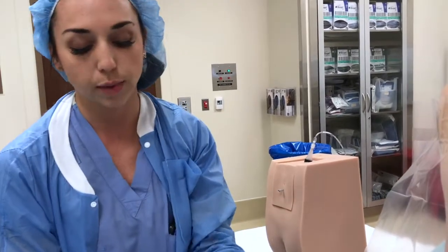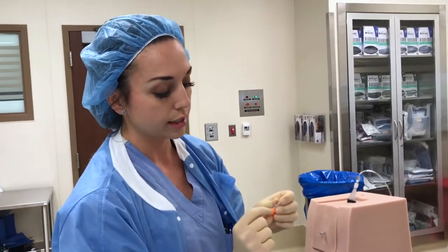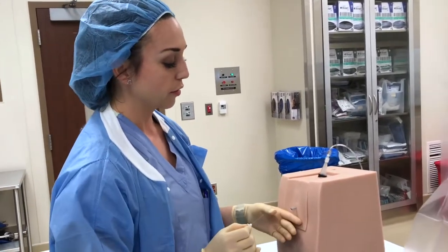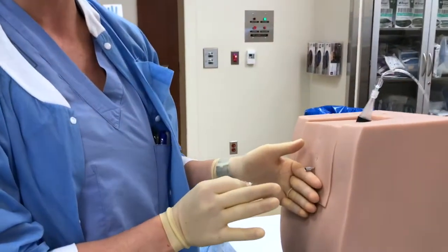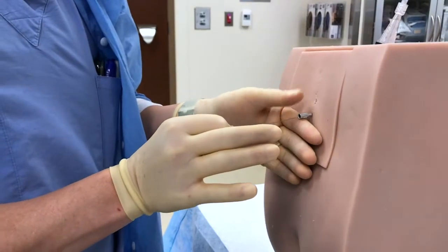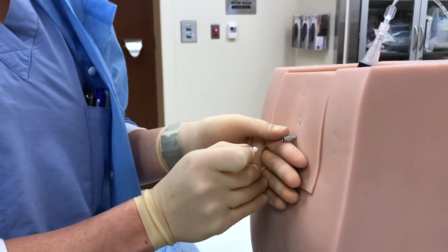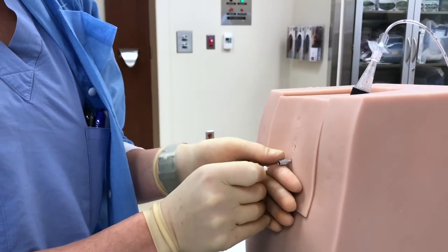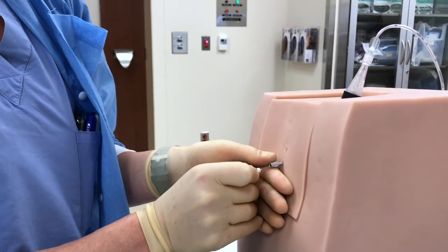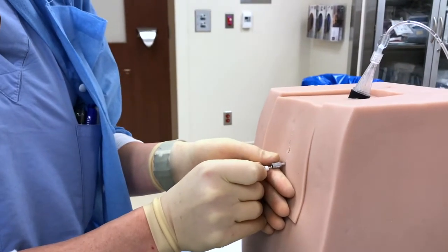And then we pick up our spinal needle, bevel up with our indentation up over here. And very carefully hold the introducer needle and hold your spinal needle very gently and carefully. Advance. And on the spinal needle, you should feel 2 pops. The first one is that ligamentum flavum before the epidural space, and then the dura mater, the tough mother. And then, there we go, pop, pop.